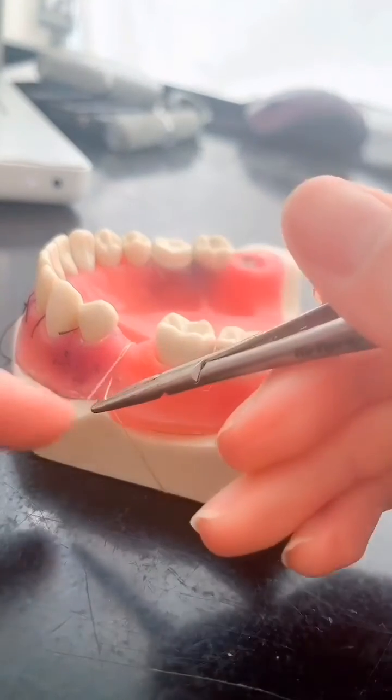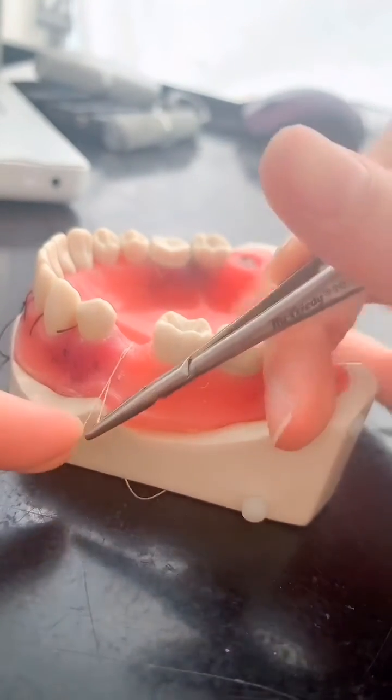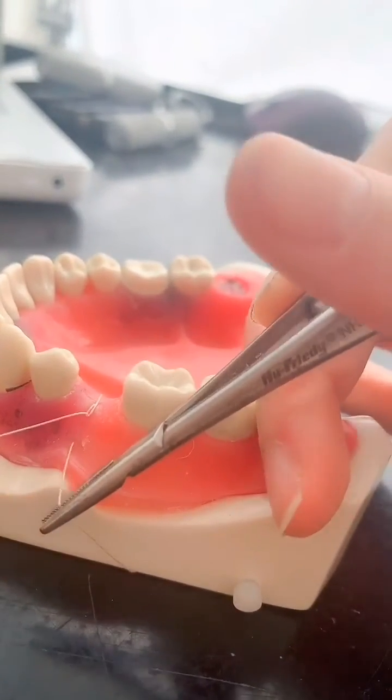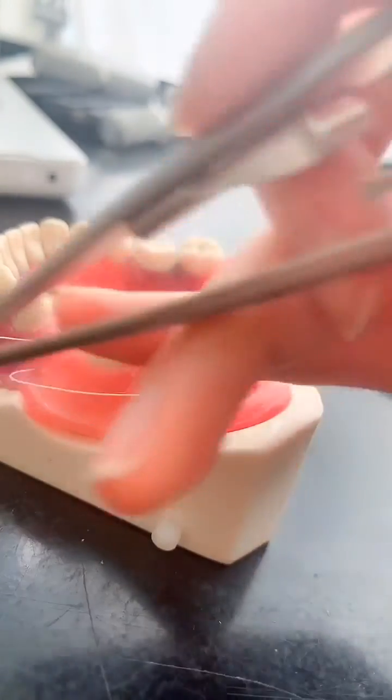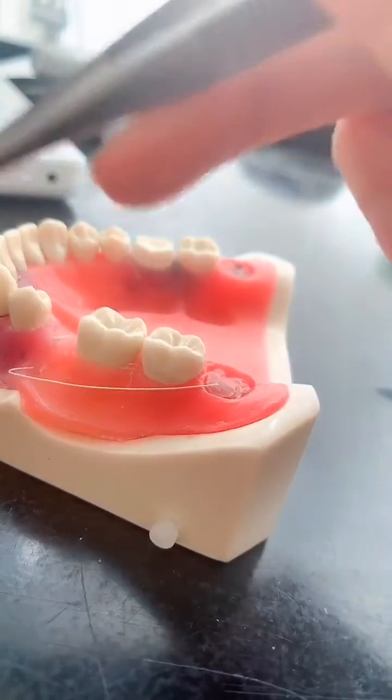And then you just pull, and you'll see this incision come together very nicely. You want to pull this one too so you can see that come together very nicely, and then you just tie it.